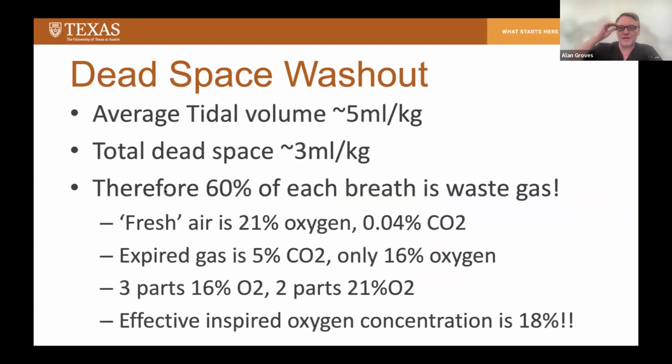So what does that mean? Well, it means that for each tidal volume, which we all know we dial in at 5 mL per kilo in the first instance on our ventilators, and that tidal volume seems to be about the same in babies that are breathing CPAP or high flow or not on any respiratory support, well, that means that of each breath, which is 5 mL per kilo, 3 mL per kilo is dead space. That's 60% of each breath that is waste gas. Every baby that we look after is trying to breathe out that gas before it can breathe in fresh gas from the room or from the respiratory support.